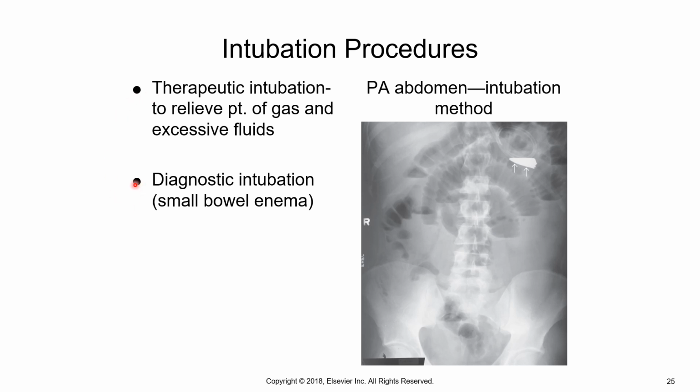We talked about a small bowel only series and the enterocolysis method. We also mentioned the small bowel follow through, which is a routine complete upper GI followed by a complete small bowel series. In those exams, the patient is with you quite a long time. For a small bowel follow through, you would do your scout image and go through all the fluoro for an upper GI.